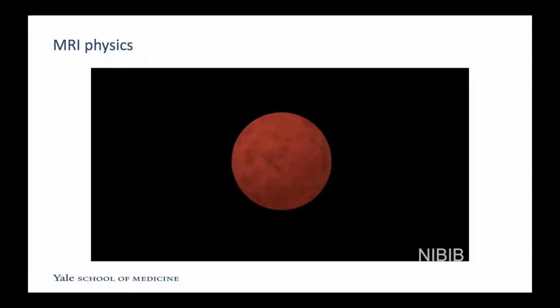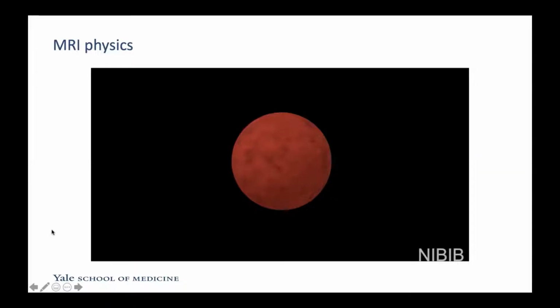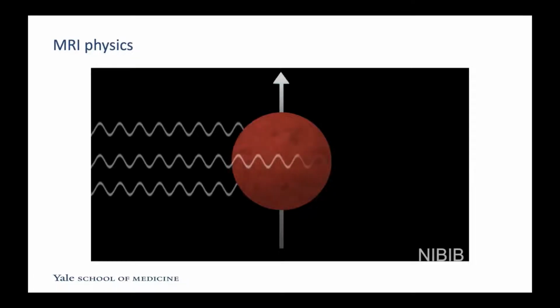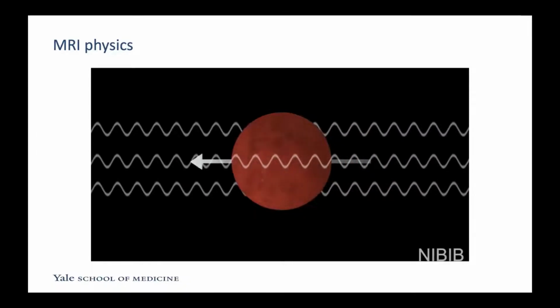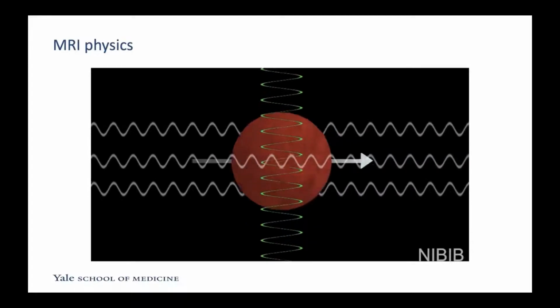But before going to the MN1 mutated astroblastoma, I would like to give a brief introduction of the physics of MRI, something very, very quick, actually. So we know that the body is full of protons, we are full of protons, and the magnetic resonance imaging, which is just a large magnetic field, basically utilizes these protons to measure the tissue, to see the tissue morphology in our body. So we know that the spin of the protons creates a magnetic field. So when I put these protons inside the bigger magnetic field, these protons will realign according to this magnetic field. Now, if I apply radio frequency pulses, these protons basically realign by 90 to 180 degrees with the big magnetic field.